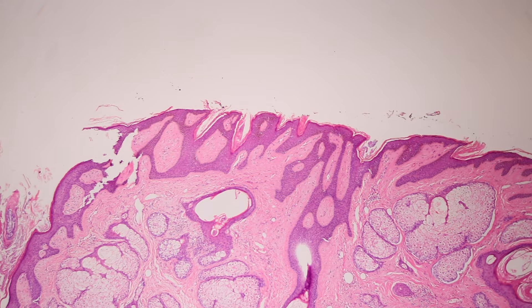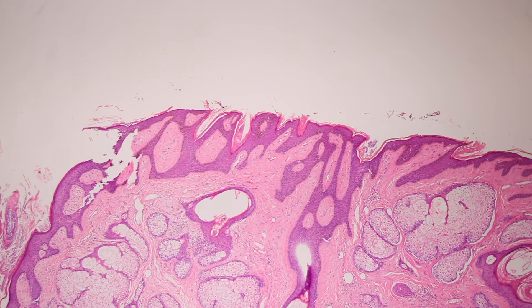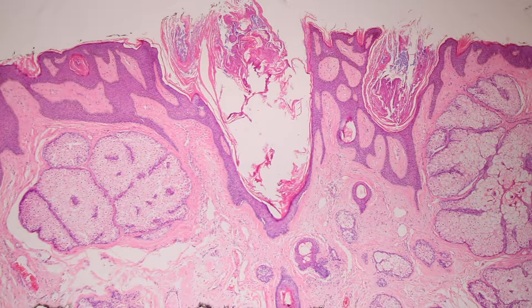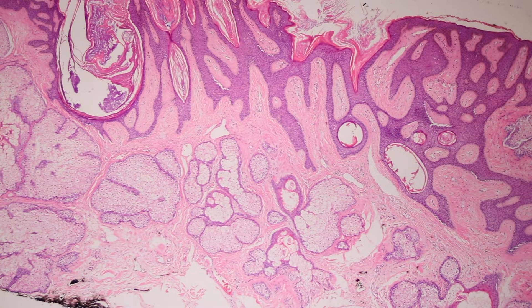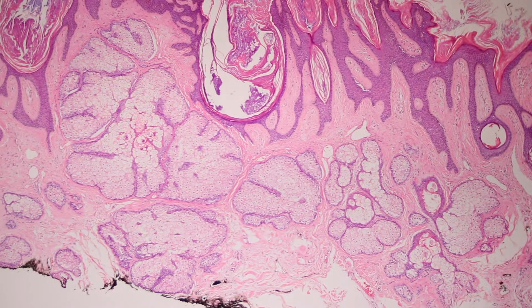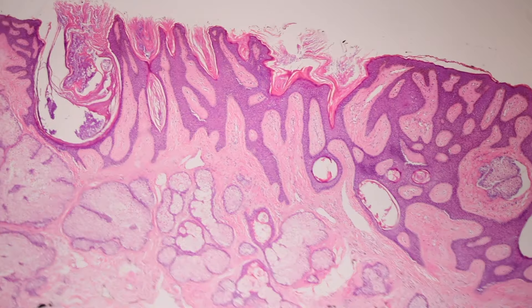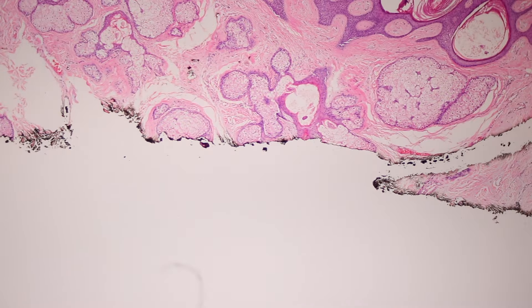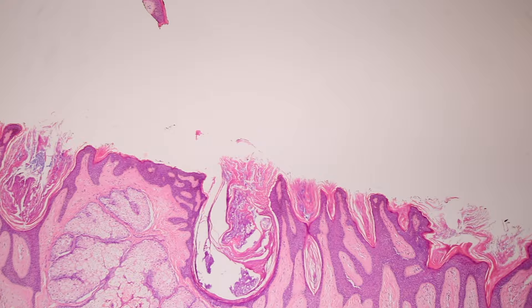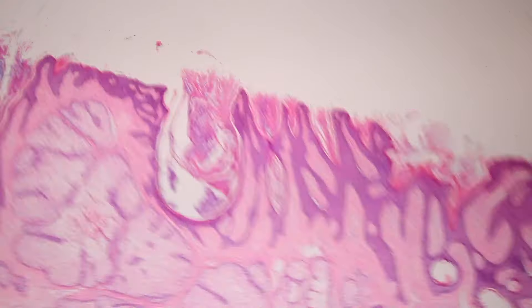Sometimes the epidermis is not very remarkably changed in some nevus sebaceous, but you'll have the underlying adnexal abnormalities with the sebaceous glands and apocrine-looking sweat glands. And one thing notably absent here — very little in the way of hair follicles even though we're on the scalp. Big massive sebaceous glands, but no big hair follicles. That should be your clue to nevus sebaceous.